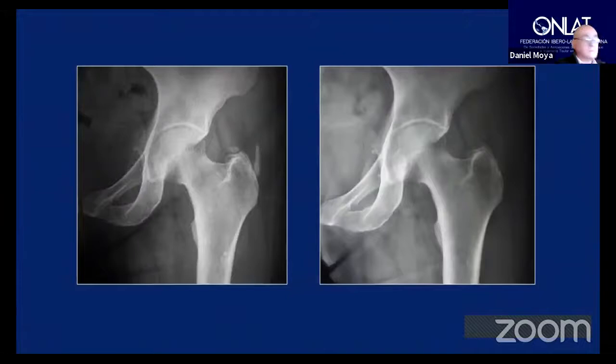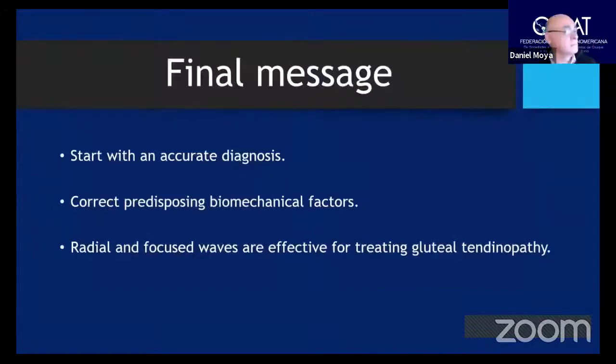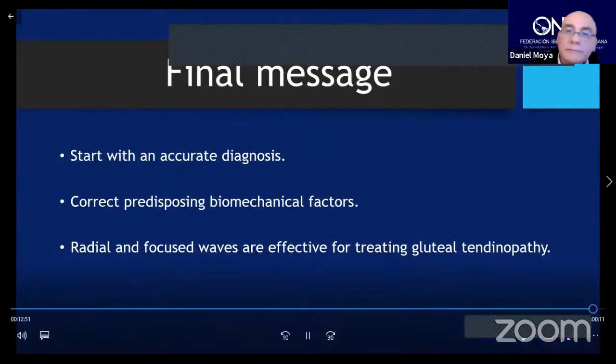In some cases, we have shown that the calcifications in the area of the trochanter disappear by the effect of the focus waves. So the final message is that we must start from a correct diagnosis, which is not always easy. We must correct predisposing biomechanical factors, and both radial and focus waves are effective for treating gluteal tendinopathy. Thank you very much.